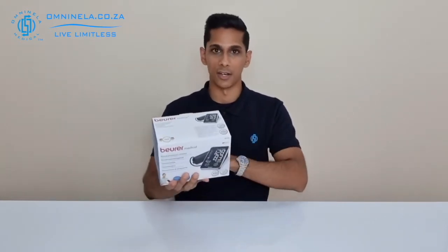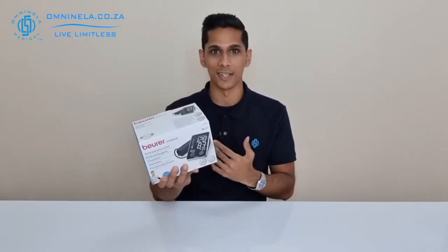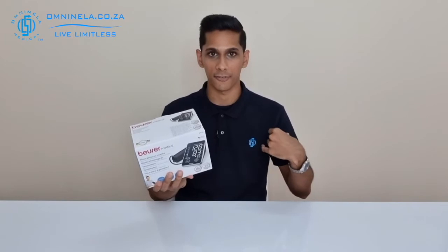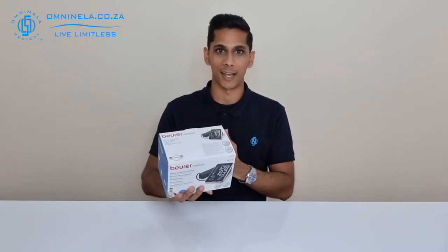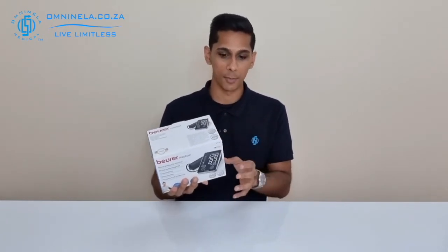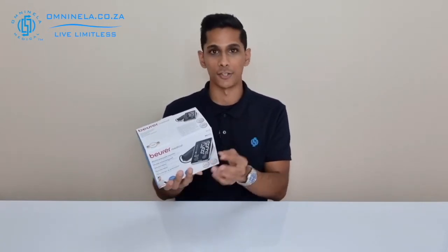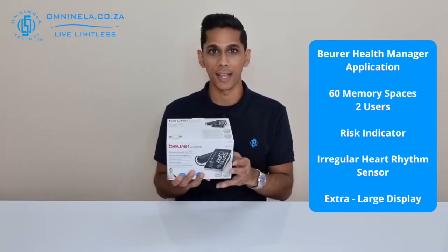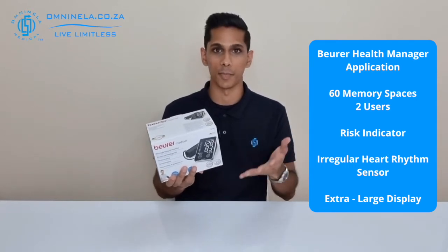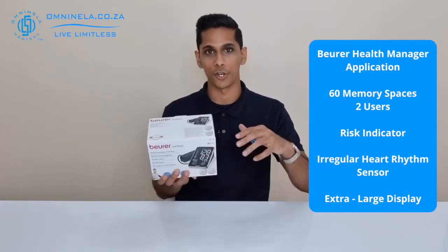Looking at the outside of the box and the features listed on it, we can see that this comes with a 22 to 30 centimeter blood pressure cuff. You'd always want to double check the arm size you are going to be testing — if you have a larger arm size, definitely check it because this is on the more medium size bracket. This also has two different users that can be registered on the device, and each user has 60 memory spaces to save their recordings to.